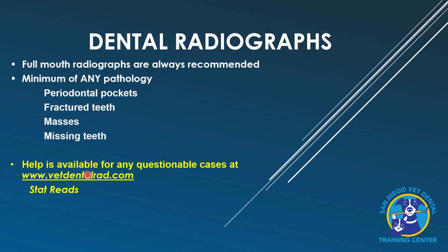I always recommend full mouth x-rays on every patient. Young large breed dogs, maybe not every time, although I always recommend it. But any problems, even those little chip fractures, as we talked about in the oral pathology section, you absolutely need to x-ray. And if you guys are taking x-rays and you're just getting started, we do have telemedicine available.